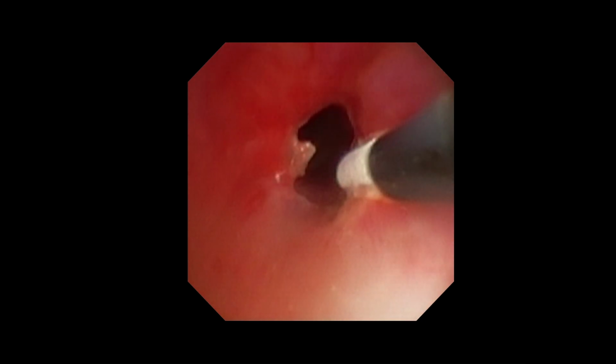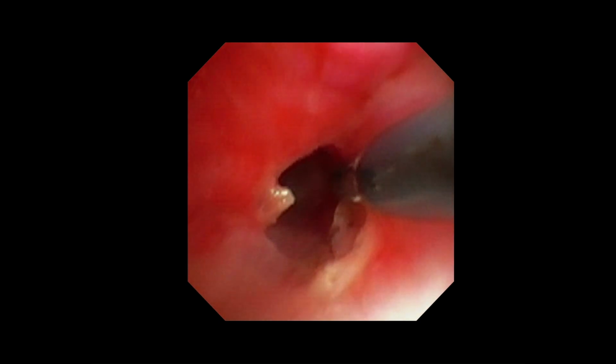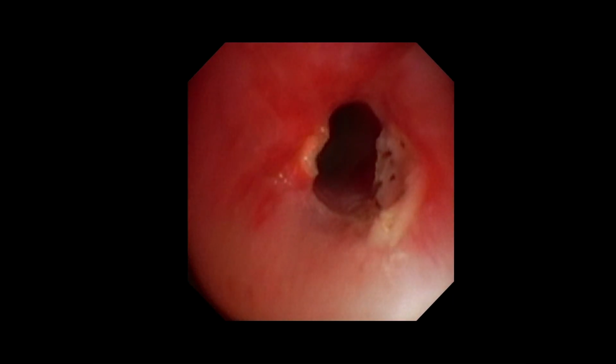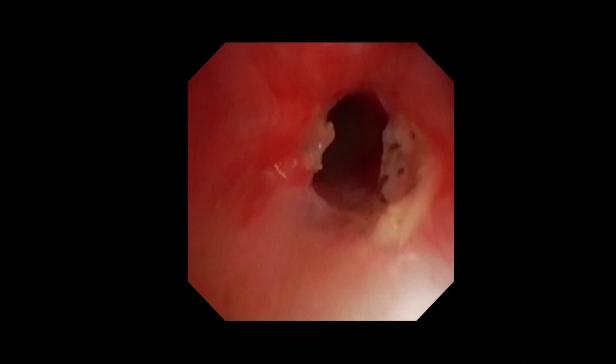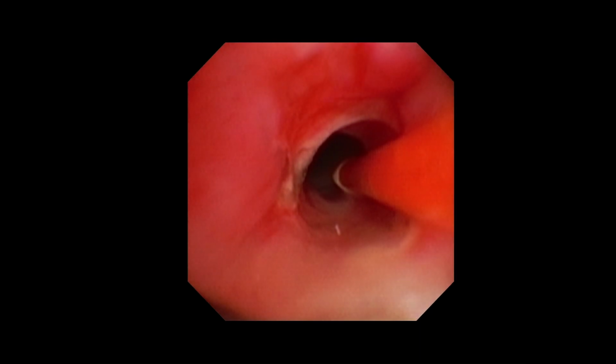And then once you complete the cryo application, again you can use a balloon to dilate the stenotic segment. That completes application of the cryoprobe, and then again a balloon is inserted.